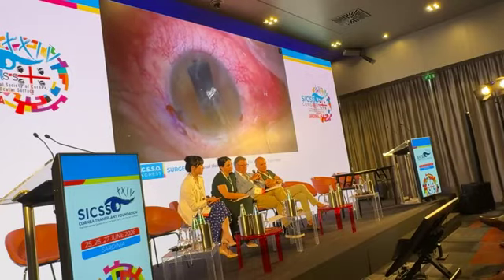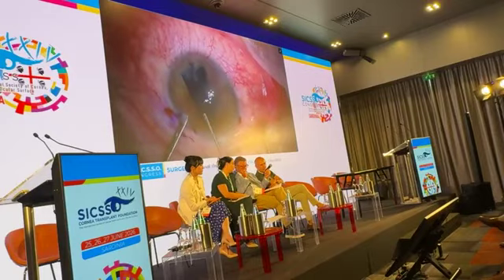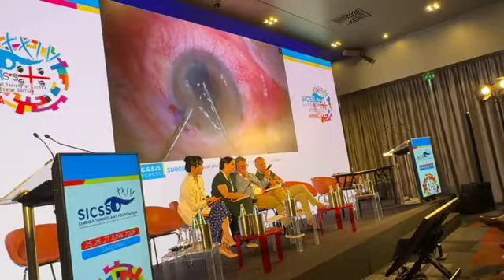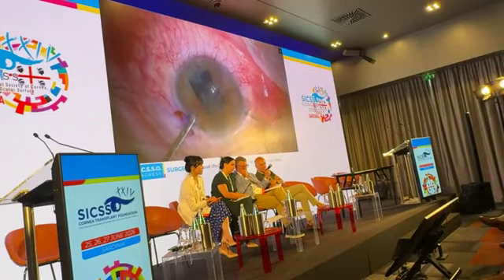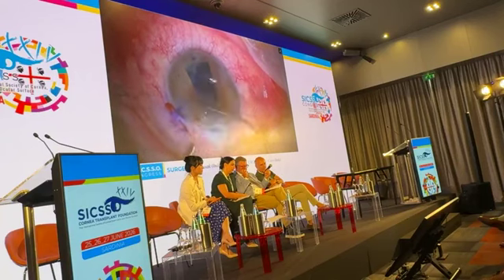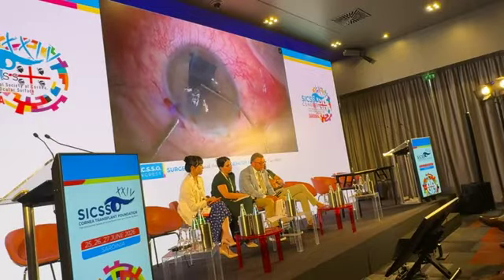And now he is performing the tapping maneuvers. Trying to keep the eye still, working with a shallow anterior chamber. And as you can see with this tapping, he's gently unfolding.